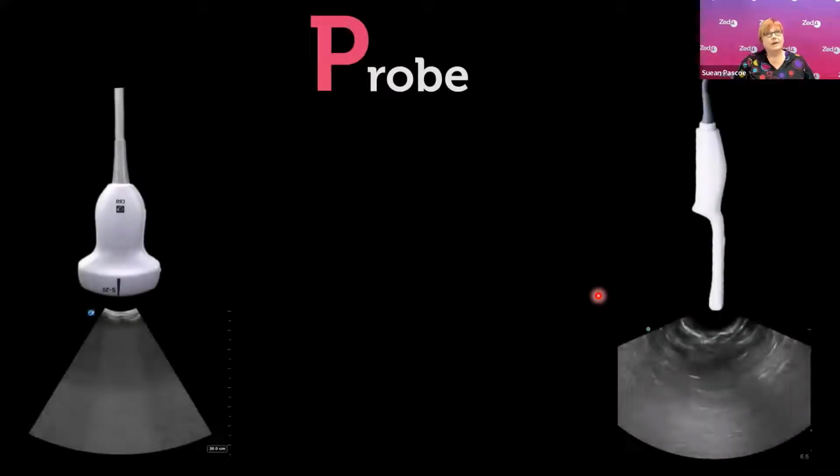And so in that sort of grey zone, in that sort of 5 to 8 week mark, it's preferable that we do a transvaginal examination. Depending on your patient's body habitus, it may be preferable that you need to do a transvaginal examination. But on some people, we can see things quite nicely with a transabdominal, and perhaps that's the only probe that you have available to you. So you need to choose the right probe for the job.